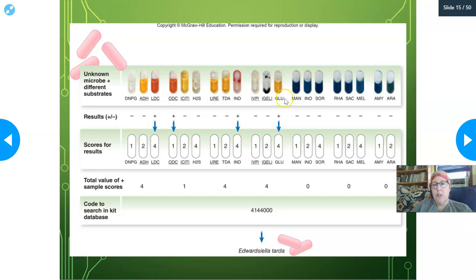And then in this series here, a negative reaction is blue and a positive reaction is yellow. So anyway, the machine detects the stuff using spectral photometry, looks at color changes and all that. And then it will read it after the appropriate incubation time. And so it will go negative, negative, positive, et cetera.